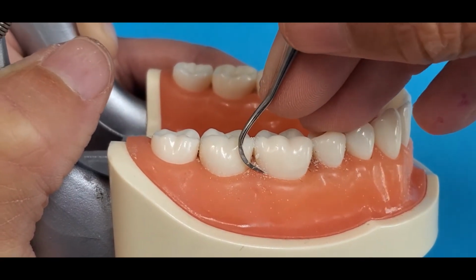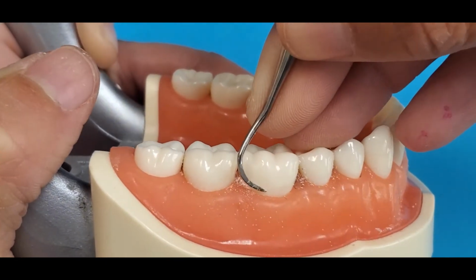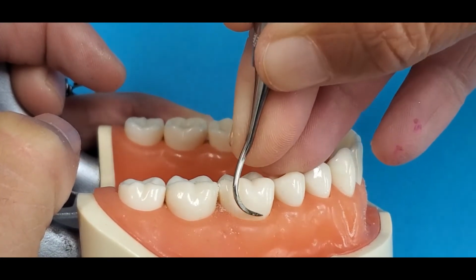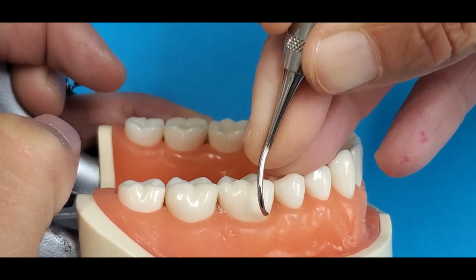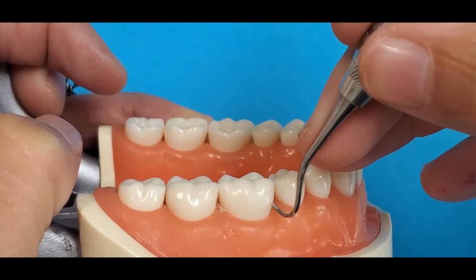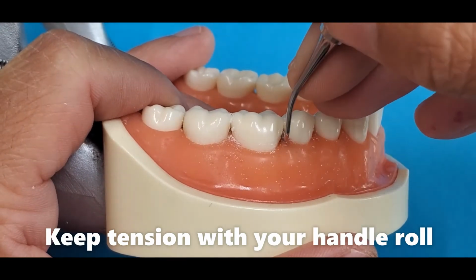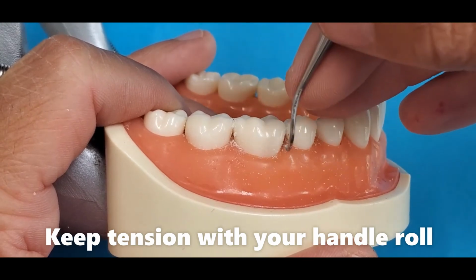Position the tip at the distal line angle and begin your oblique strokes around the tooth surface. Staying on the tip. When I get to the line angle, I'm going to stop. I'm going to turn the instrument. This is going to be tricky, especially on molars when you're fulcruming on the opposite side of your instrument. You want to pull the instrument this way towards your fulcrum and it needs to go towards the tooth.